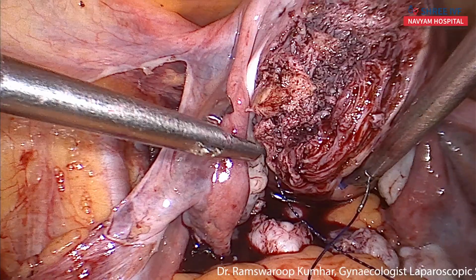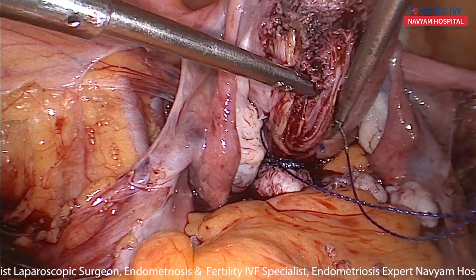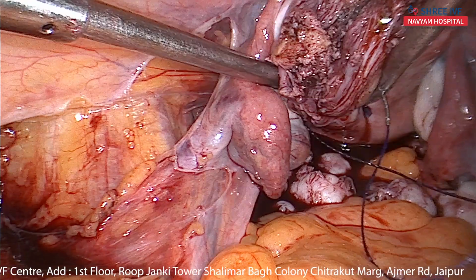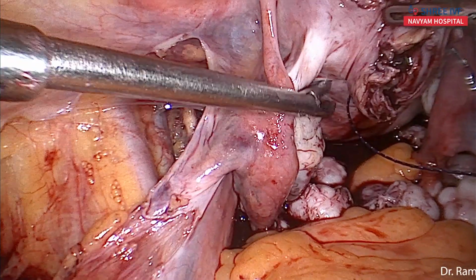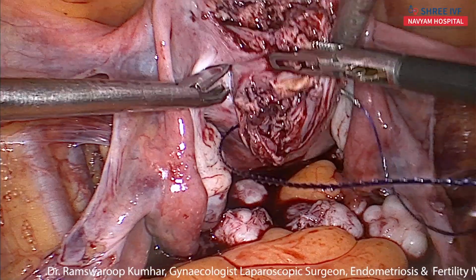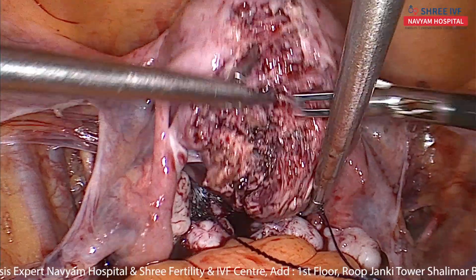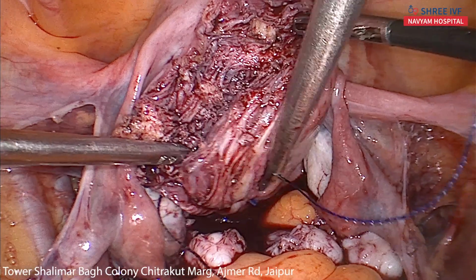Full thickness bite. Full thickness bite on this side. It came a little near to the previous suture, so I'm trying to take it out from another place. No, the needle has slightly moved. No, I'm not getting it. Okay. So I will take it one by one.